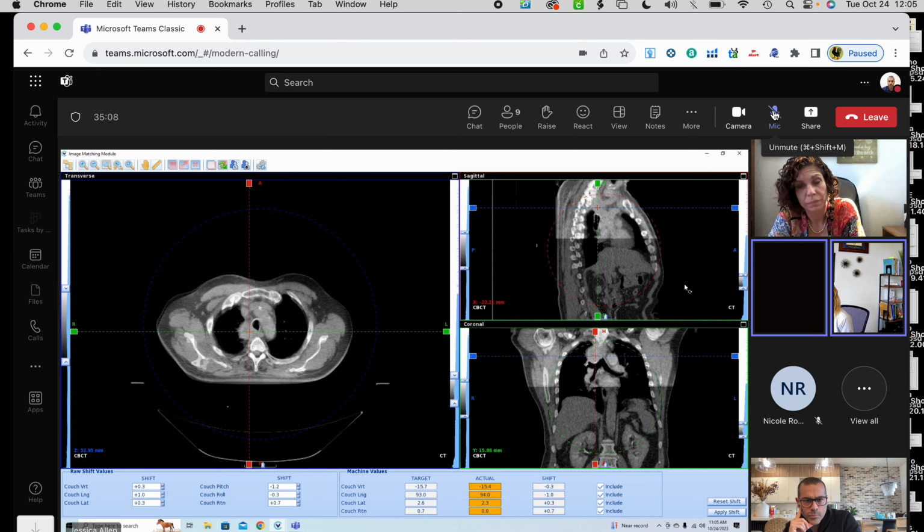And no, Diego or Kelly, don't answer. Y'all were already in that conversation. So which one can I move yaw? And what is yaw? Is yaw where it's like tipping side to side laterally? Yaw is the couch rotation. Okay. All right. I'm sorry. Go ahead. No, you're good. Tell me. I think that would be in the coronal view. Yep, and watch it. You see it moving?